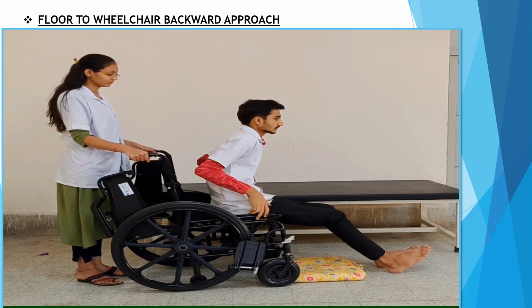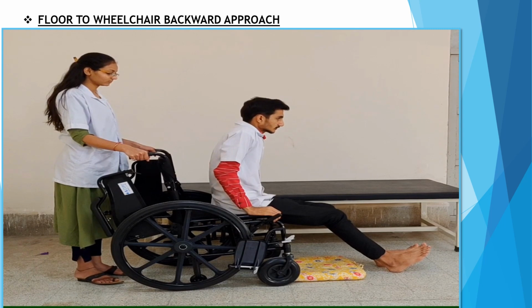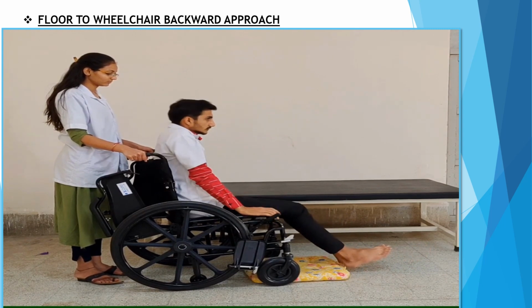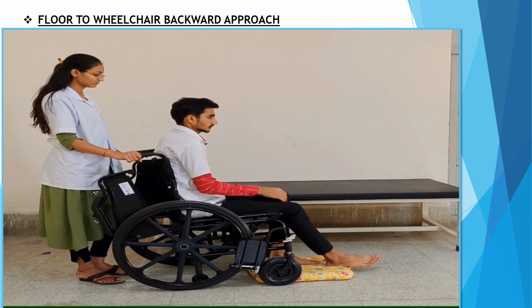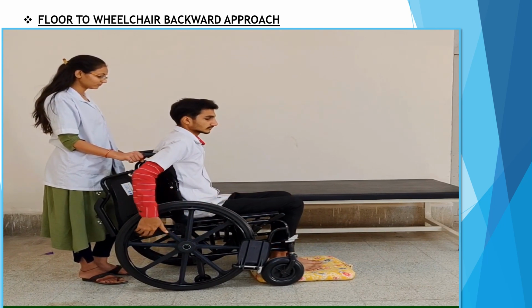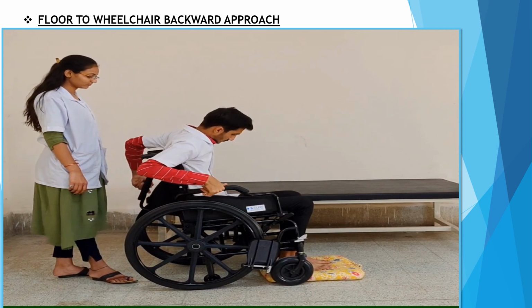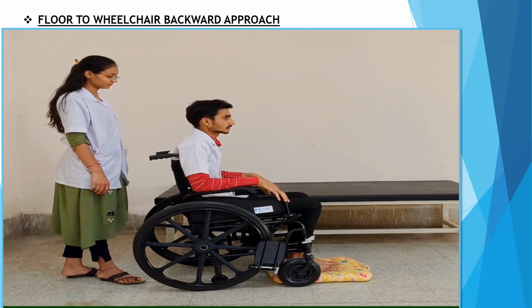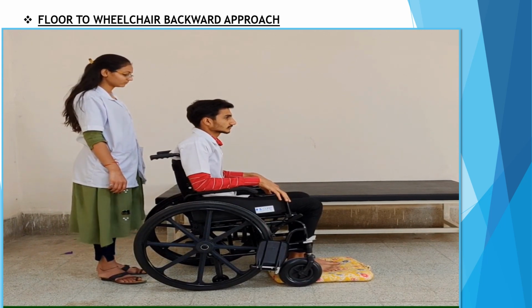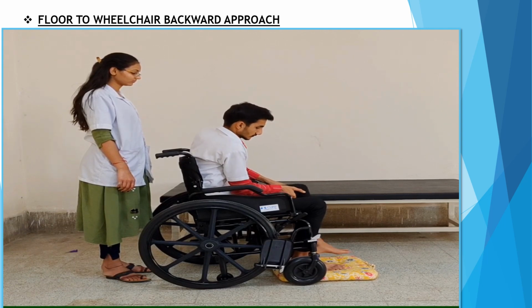Step 3. Sitting into an upright position. The patient holds the wheelchair to shift himself into a comfortable upright position. Putting the armrest down, the patient will then lift the cushion from the floor and put it by the side of the seat by folding it in half.